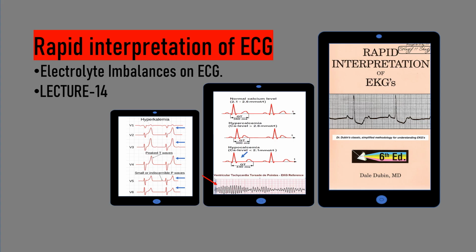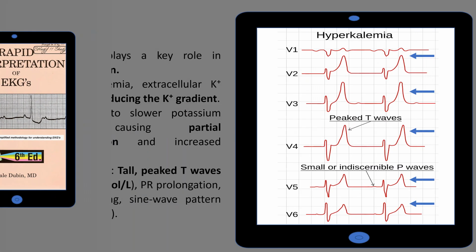Welcome to our 14th video in rapid interpretation of ECG series. Let's talk about electrolyte imbalances and their impact on ECG.